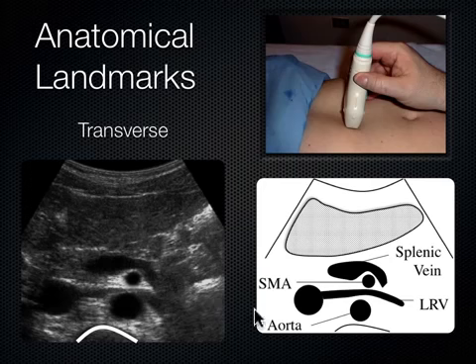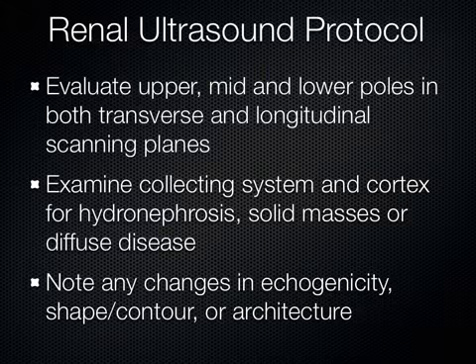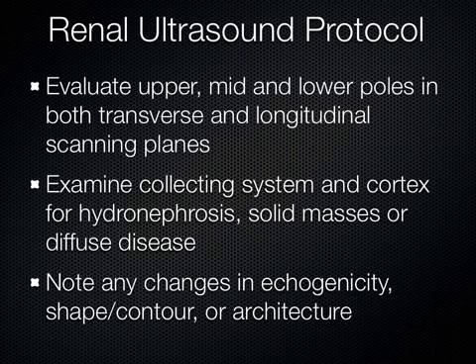So here's the left kidney, not seen on the screen. It's over on this side of the body somewhere. And its blood supply is sort of analogous to the right side of the body where we just were, how the right renal artery had to go behind the IVC to get to the right side of the body. Well, on the left side of the body, the left renal vein has to get over to the right side of the body to drain into the IVC. The way it does that is it gets nut-cracked between the aorta and SMA and gets into the IVC. Cool?